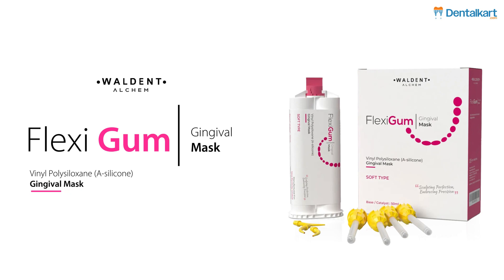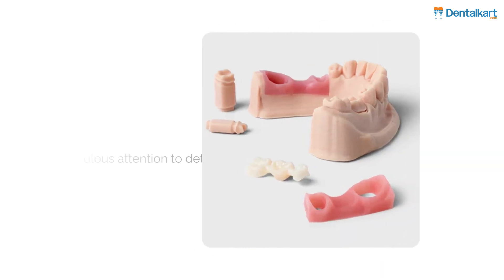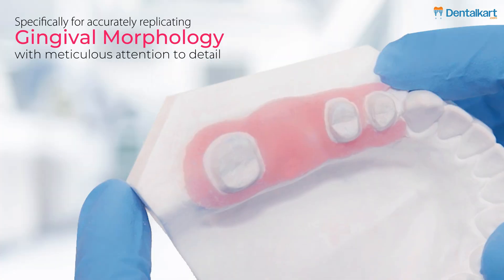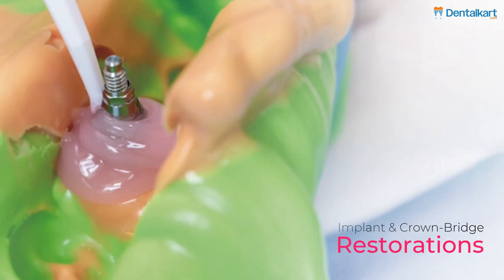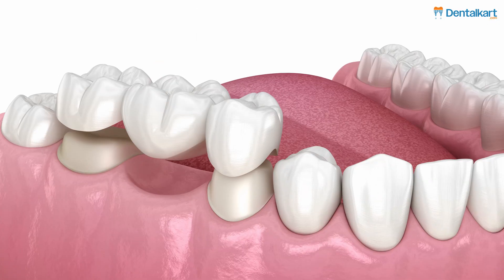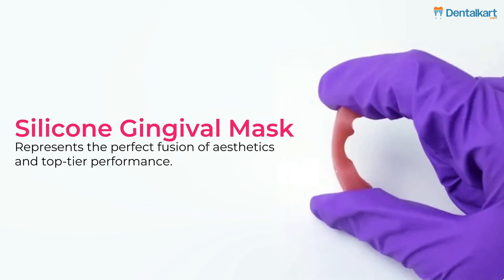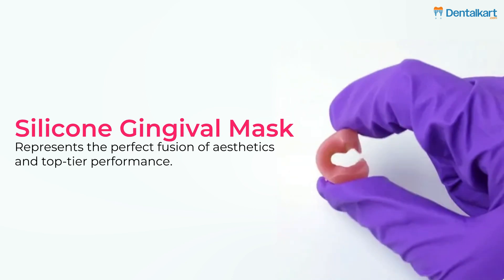Introducing the Walden Flexigum Gingival Mask, an addition curing silicone designed with meticulous attention to detail, specifically for accurately replicating gingival morphology in implant and crown bridge restorations. Tailored for both crown and bridge prosthesis as well as implant restoration, this silicone gingival mask represents the perfect fusion of aesthetics and top-tier performance.